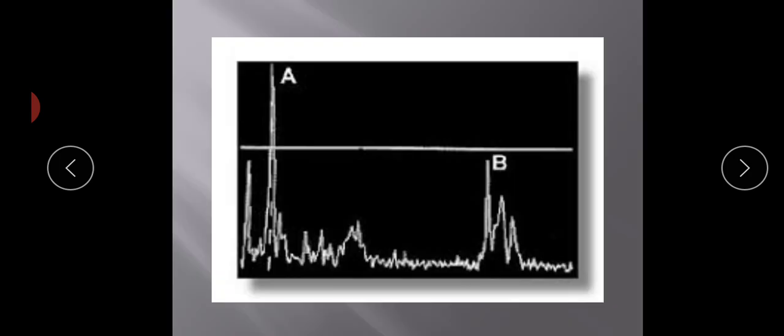Here is a graph of A mode. In A mode, echoes are displayed as spikes projecting from the baseline. The baseline identifies the central axis of the beam. Spike height is proportional to the echo intensity, with strong echoes producing large spikes like this.